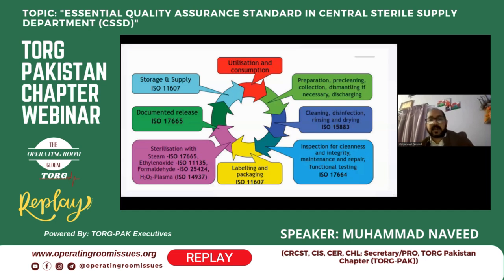When our packing and labeling is done, the next standard comes. If we are using steam sterilization, it is ISO 17665. If we are using ETO, ethylene oxide, formaldehyde, and H2O2, there are different standards we have to achieve for the sterility assurance level. After sterilization, we have to check. This standard says how we can release the instruments after sterilization, and what things we have to check before releasing the instrument.